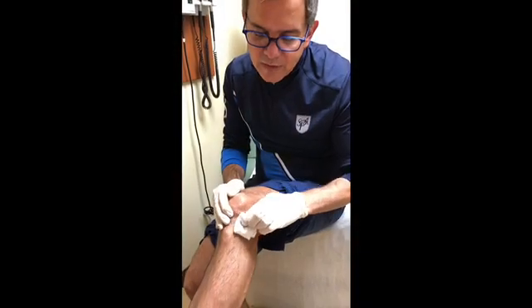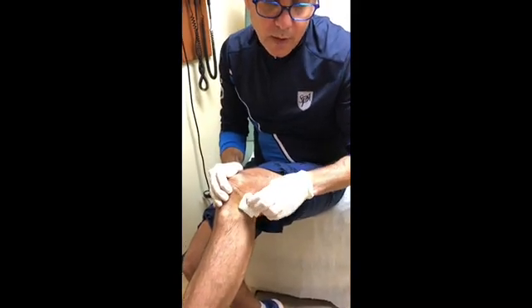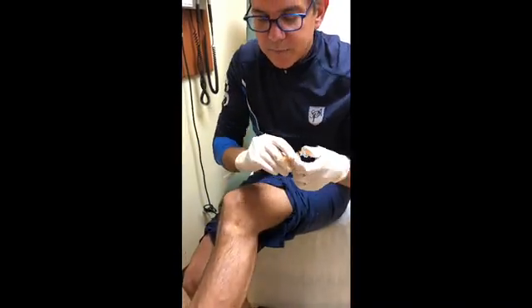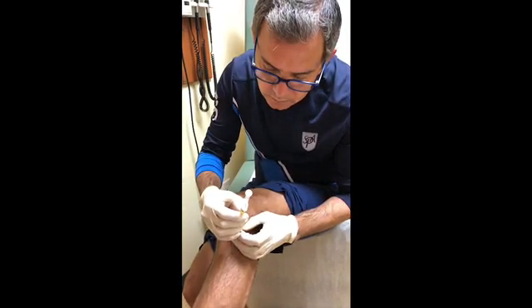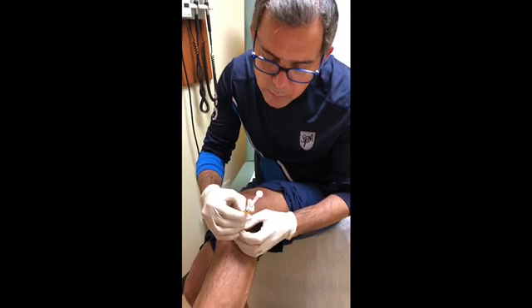I'm prepping for the left knee, and I should inject in the same fashion as the right knee. I get a little support and — I'm in.